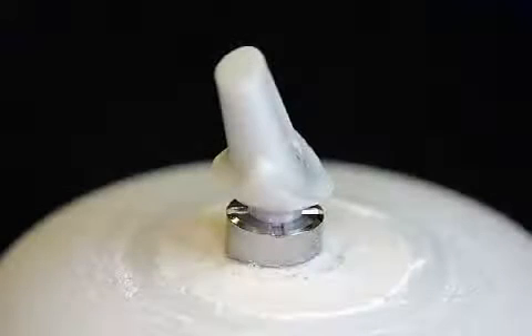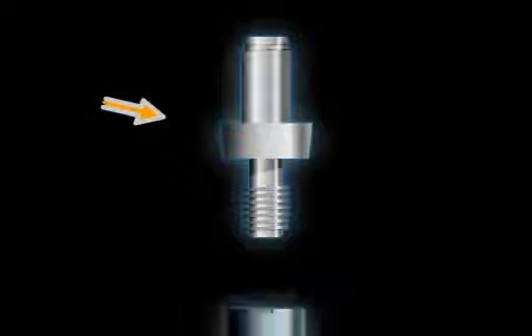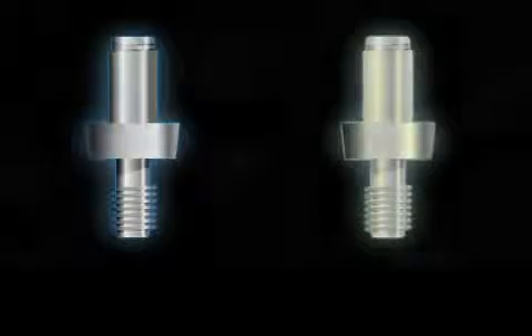Abutments are small implant attachments that serve as connectors between the implant and the crown. Abutments can be made from titanium or ceramic.